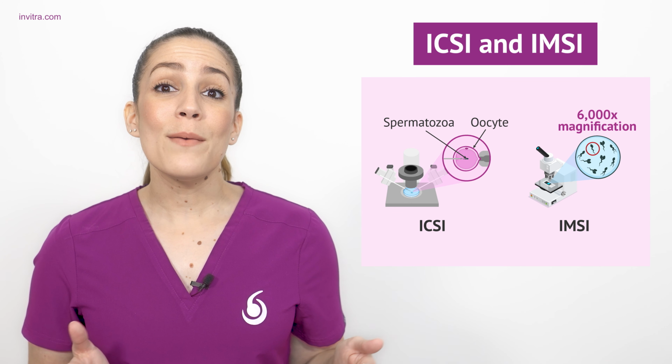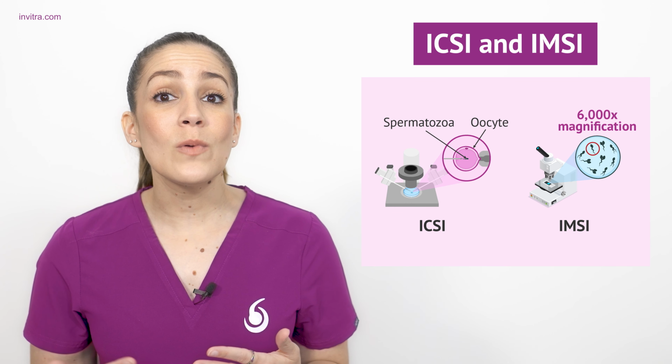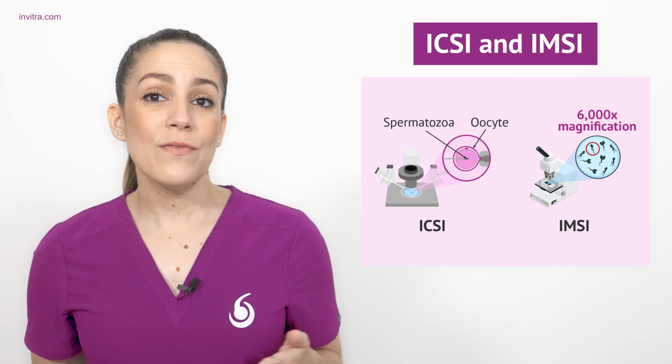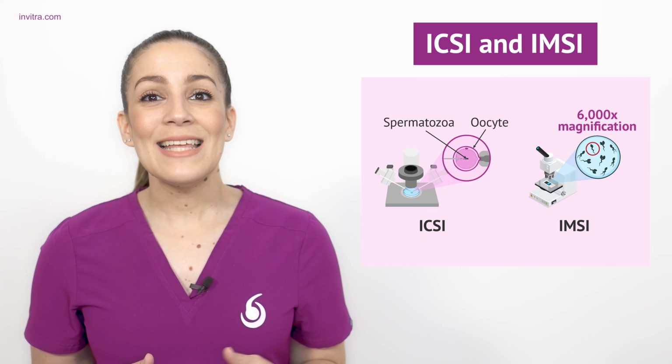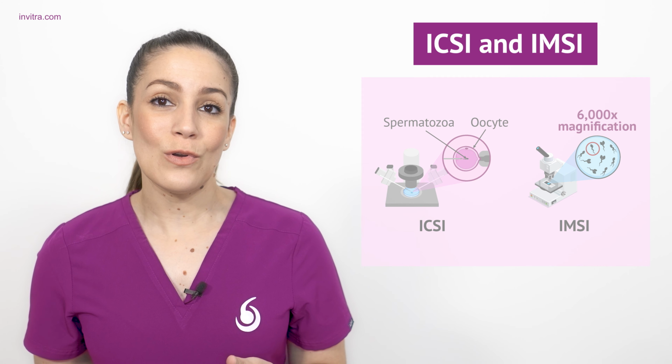This capability enables a more accurate assessment of sperm morphology and provides superior visualization of the vacuoles located within the sperm head. This modified ICSI technique is formally known as the IMSI technique. These acronyms stand for intracytoplasmic morphologically selected sperm injection.